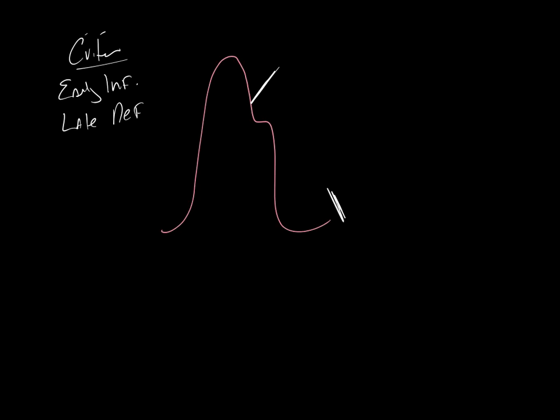What's going to happen typically as you have changes in altitude and barometric pressure to your balloon pump? It's going to stop, right? It'll stop and it'll reset itself to the new pressure. So you want to anticipate that if you're flying somebody and you have change in barometric pressure, the machine's going to stop, it's going to reset itself, and then it'll start back up again. So your patient might deteriorate while the balloon pump is doing that.